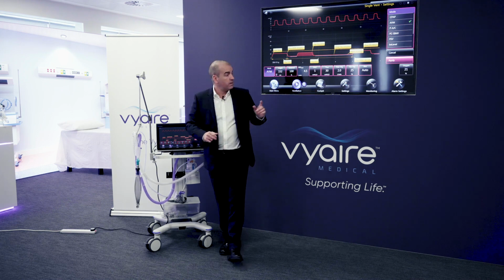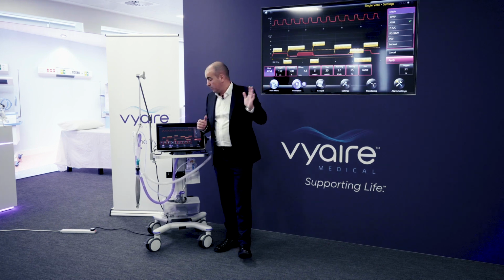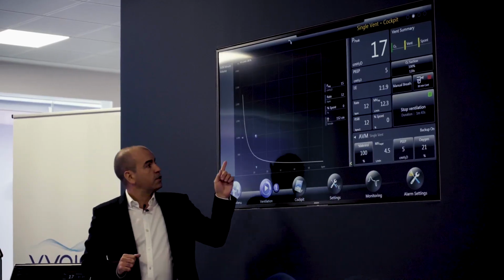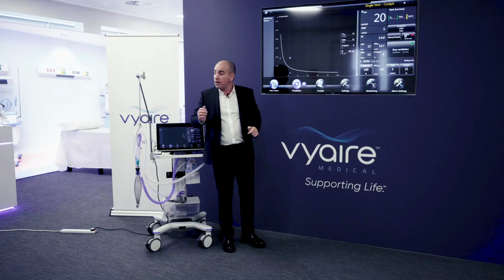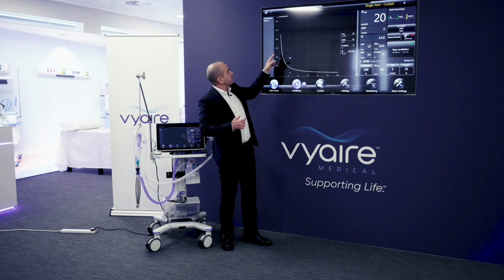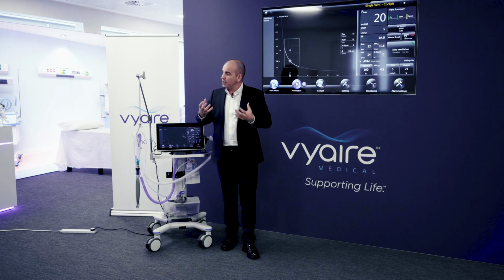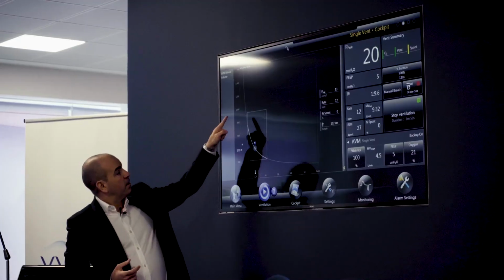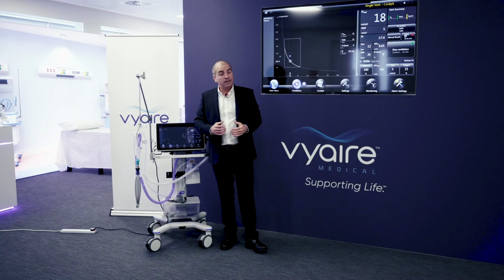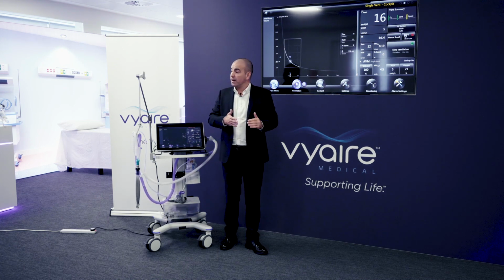Okay? So here, this is our staging area. You set everything up how you want it, and only when you're comfortable would you then hit apply. So on the screen here, we have a white line. So we know we put a female patient in of X centimeters. So we knew what the ideal body weight was. Therefore, from that, we can calculate how much volume of breaths that patient needs each minute. That line going along there is that volume of breath. And you can achieve that in many different ways, either with a higher respiratory rate and a smaller tidal volume, or a lower respiratory rate and a higher tidal volume.